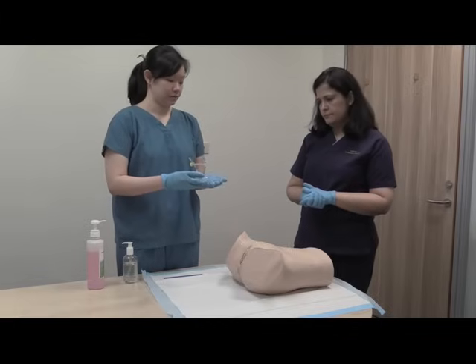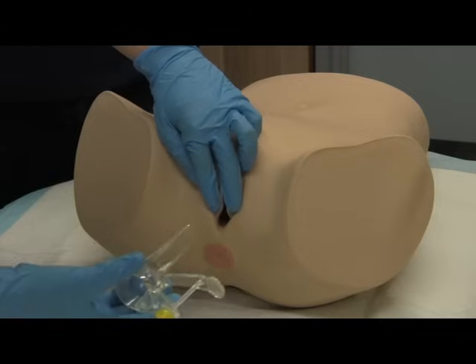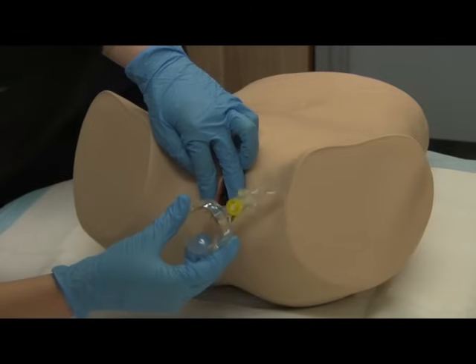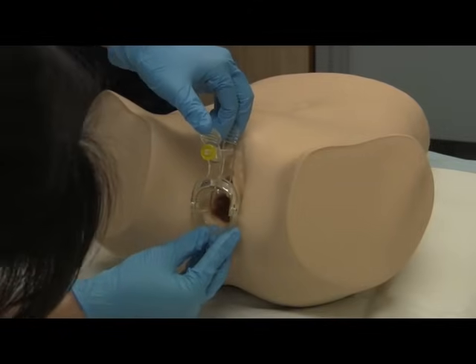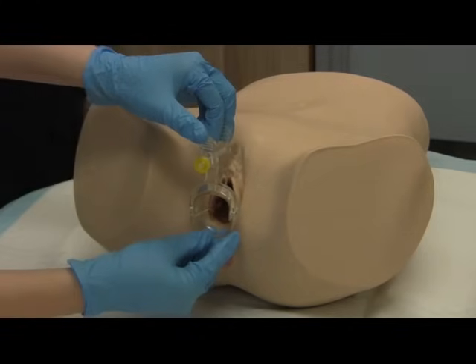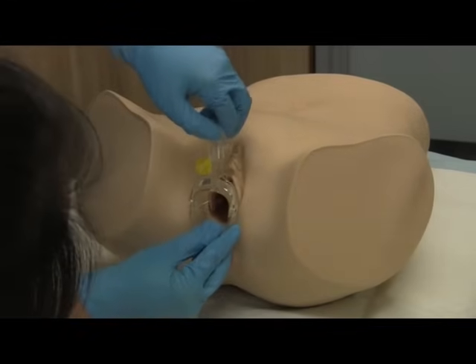We can either hold the speculum in this fashion or in this fashion — this is really personal preference. I will gently part the labia just slightly, and then ease the speculum in. Mrs. Smith, you might be feeling a little bit of discomfort now. Just relax yourself. Once I'm in, I will open to see whether I can locate the cervix. Sometimes I may not be able to locate the cervix, in which case I might need to retract the speculum slightly, readjust, and open it again.